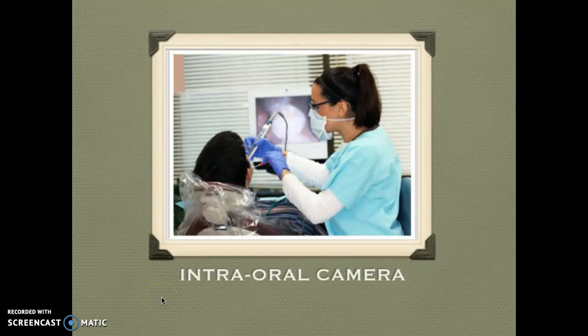Next we have an intraoral camera. Now the intraoral camera, you can see quite different equipment here, very slender camera, and it is connected to a computer, usually into the dental software.